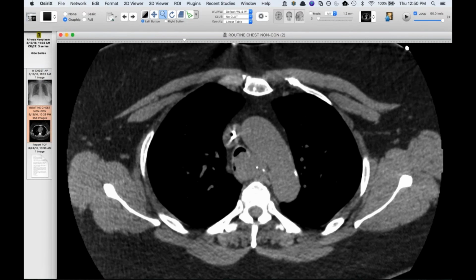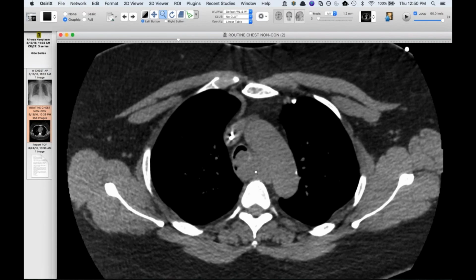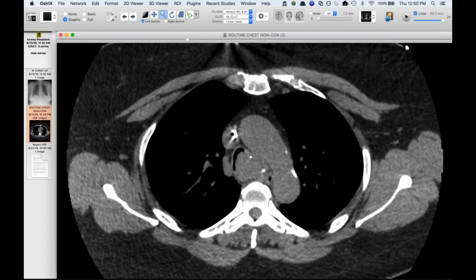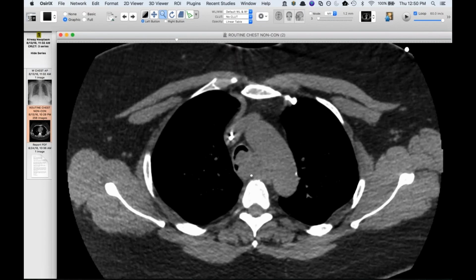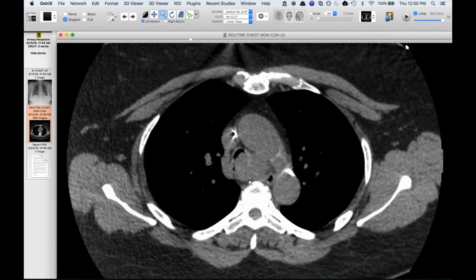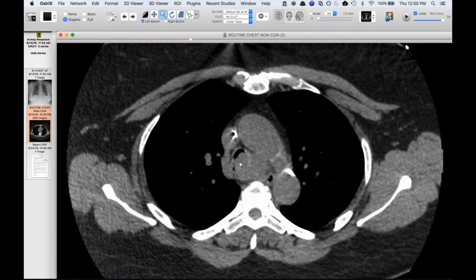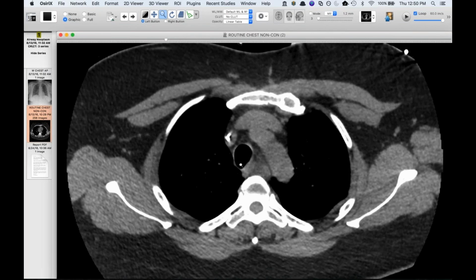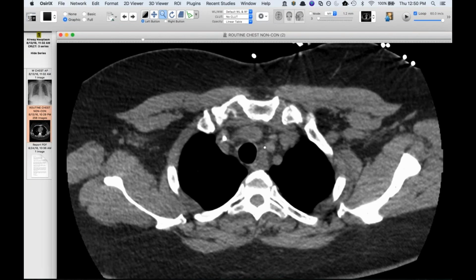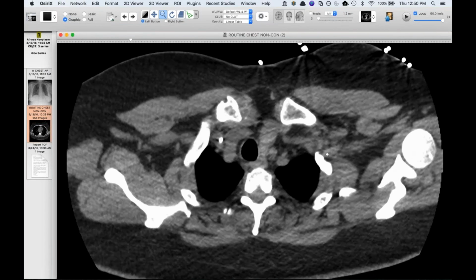And so much like Jeff's case, just in a different location, it looks like the epicenter of this thing is really in the left paratracheal space and probably eroding into the trachea, as opposed to starting in the trachea like that squamous cell and working its way out. And you can see how it kind of dips down to the carina, and this corresponds to the finding on the radiograph. She also has this other lymph node and then this huge left supraclavicular node.